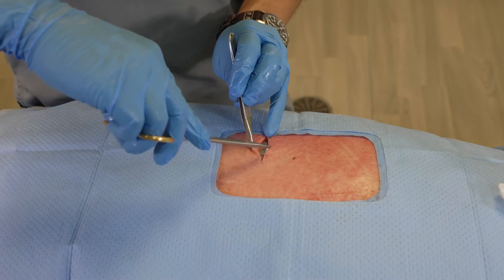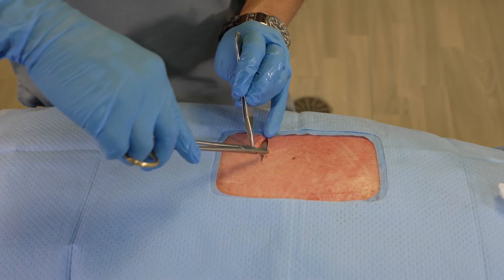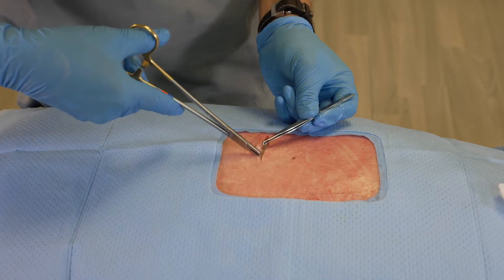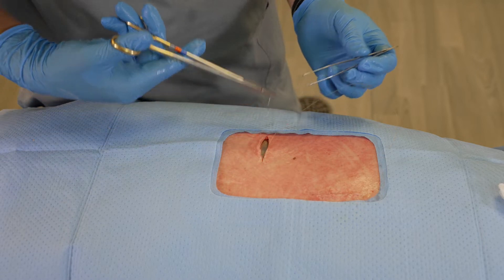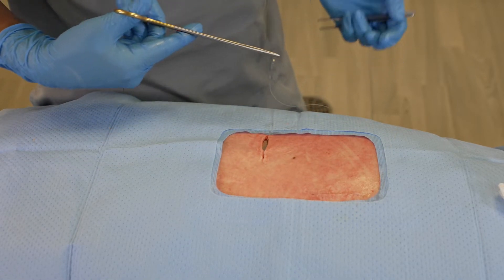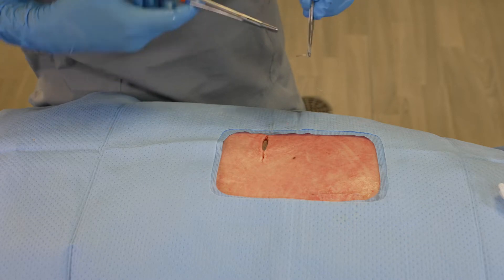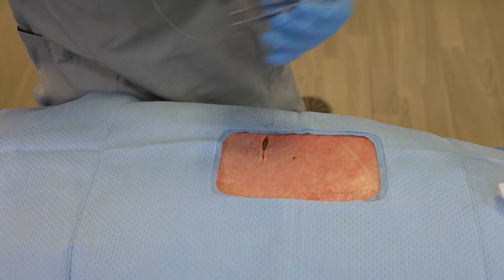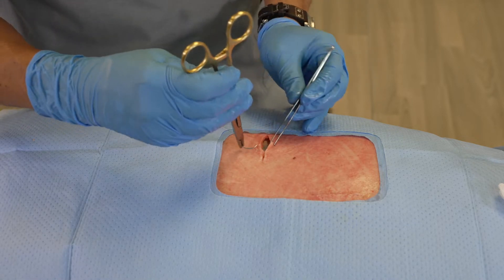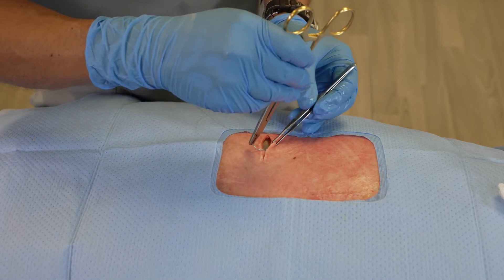So in this case, I'm just carefully taking even bites of tissue and working my suture so that I'm approximating but not strangulating the tissue.